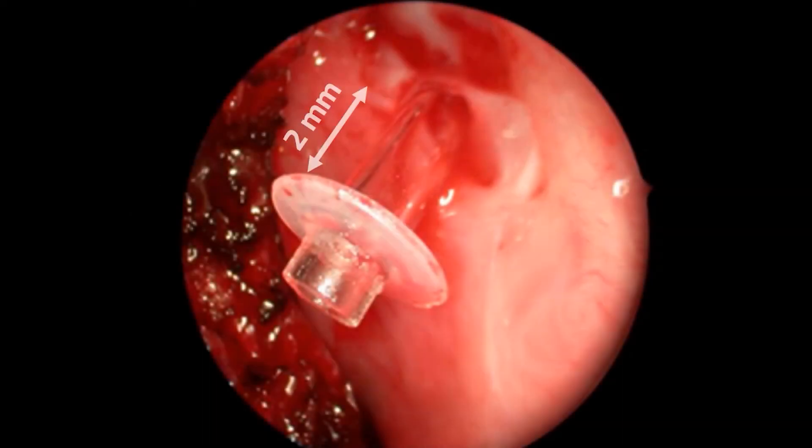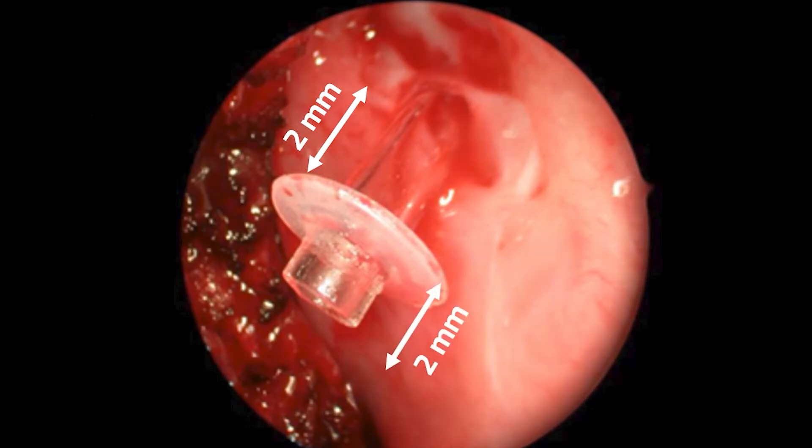The dummy tube length minus the number of rings visible in the nose equals the length of the tissue track. Then always add back four millimeters. This will be four millimeters longer than the tissue track to account for a necessary two millimeter distance from the lateral nasal wall to the internal silicone flange, and the two millimeter fixed distance from the silicone flange to the tip of the tube.